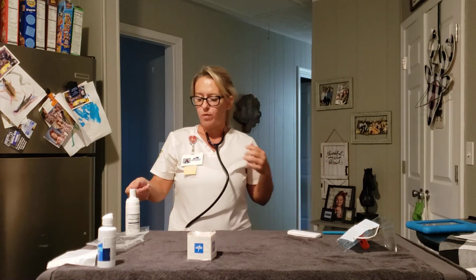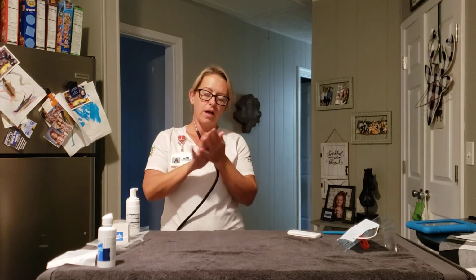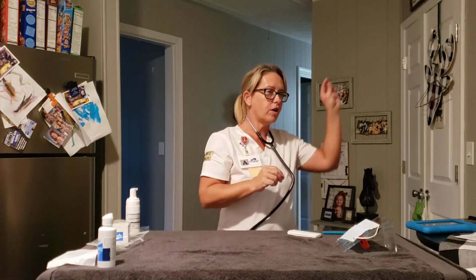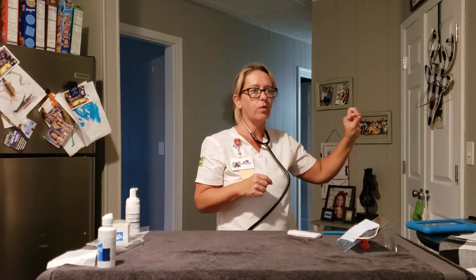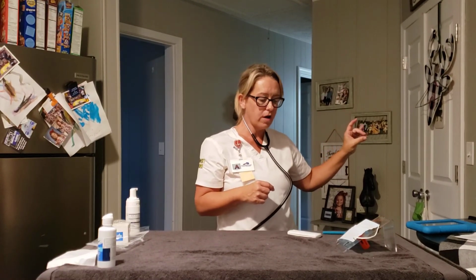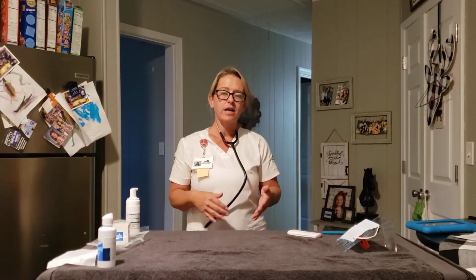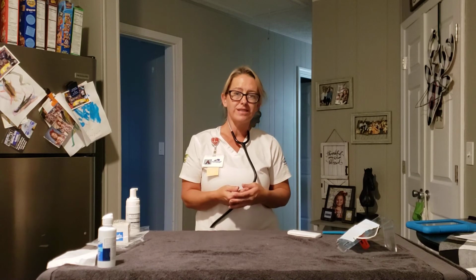Alrighty. I'm going to wash my hands. I'm going to clean up my mess here. I'm going to put her oxygen back down to what it was before, and the suctioning back down to what it was before. I'm going to lower the bed to the lowest position, give her her call light, and make sure that she is comfortable and doesn't need anything.